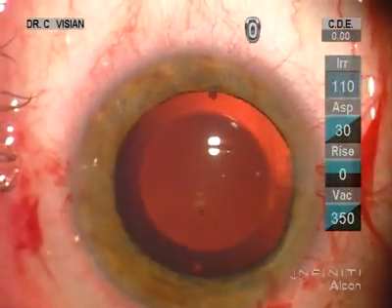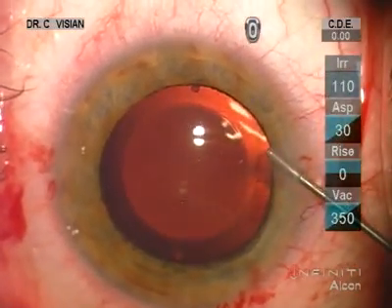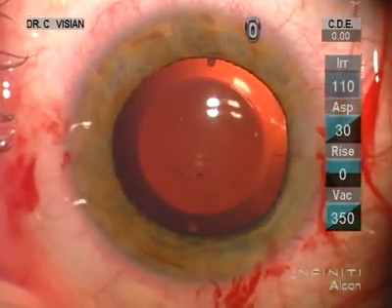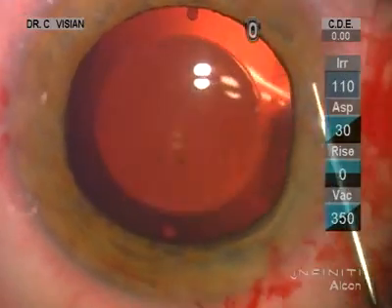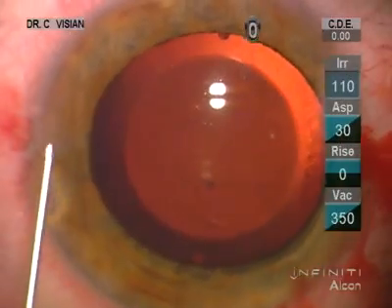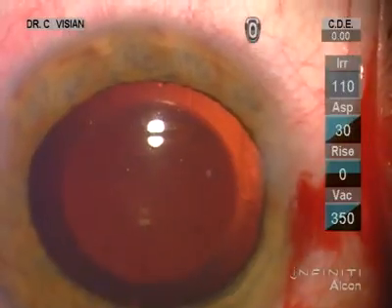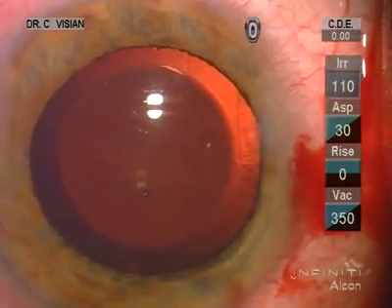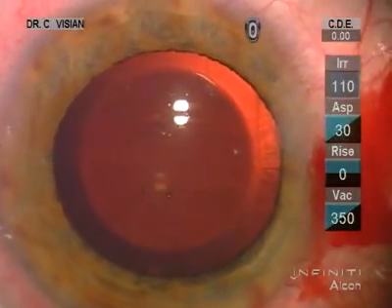Antibiotics and BSS. We'll just seal those paracentesis incisions a little bit. That looks beautiful. And I prefer not to hydrate the wound to prevent any iris prolapse. It looks perfect — must be perfect in the end.